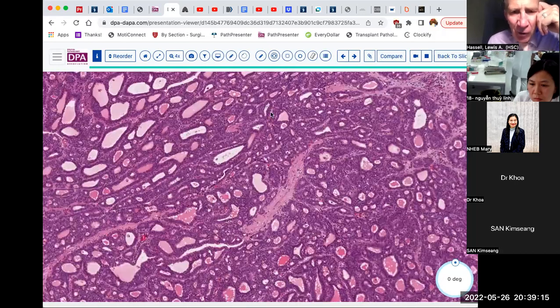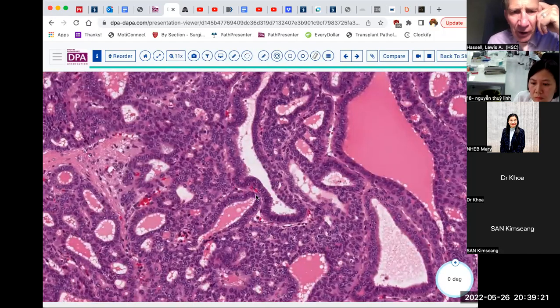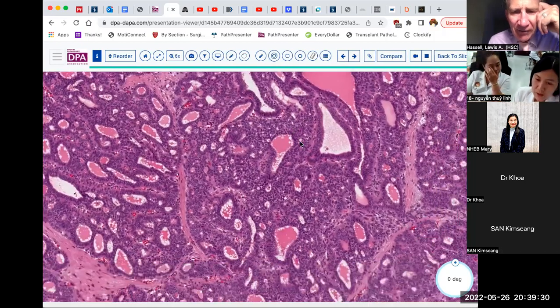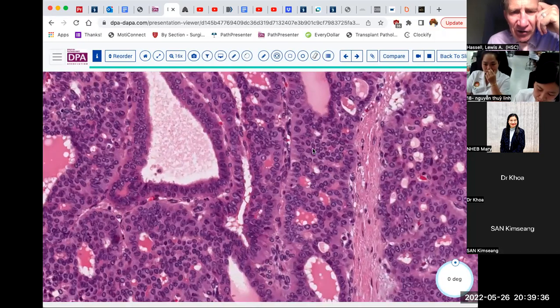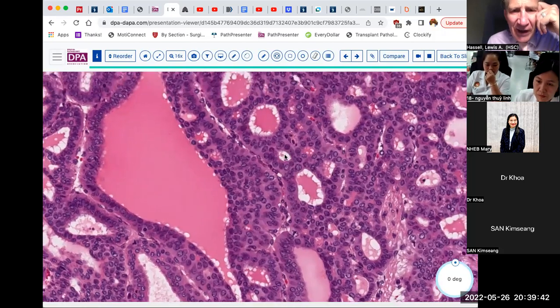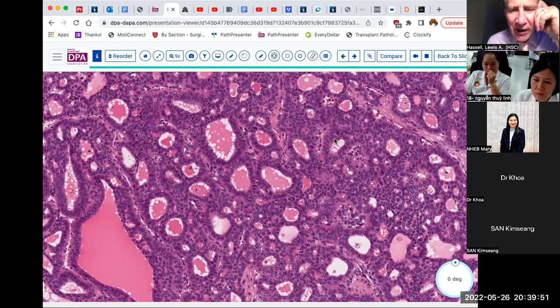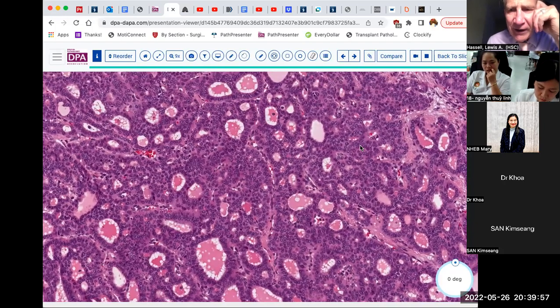And that's exactly why it's such a challenge, because you look at this and you might go, well, could this be thyroid cancer? It's got some scalloping like thyroid colloid here. Could this be something of that sort? Or could it be another tumor that makes these sort of follicle-like glandular structures? And I think it was probably that feature that led people to stain this particular tumor, which is CK7 positive, but it also has the distinctive feature of being positive for inhibin.